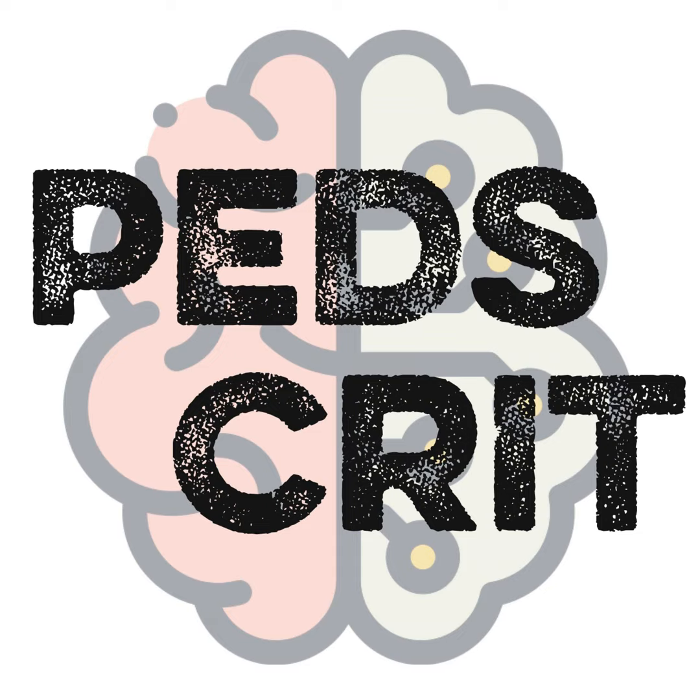The PEEP levels recommended in the low PEEP FiO2 table in 2005 when they published ALVEOLI: they tested a low PEEP FiO2 table and a high PEEP FiO2 table, and those have different matchups of PEEP and FiO2. But most PICU practitioners don't even necessarily achieve the low PEEP FiO2 table that adults would see. And there's a couple of reasons for this. One of them is that we have access to alternative modes of ventilation, and so we're much more facile with things like the oscillator. At some point, many people and many institutions, historically and culturally, feel more comfortable with the same patient on an oscillator than they do on a PEEP of 18 or 20.